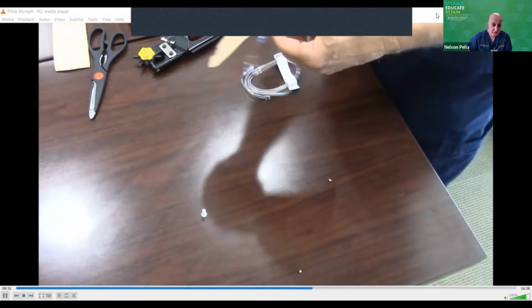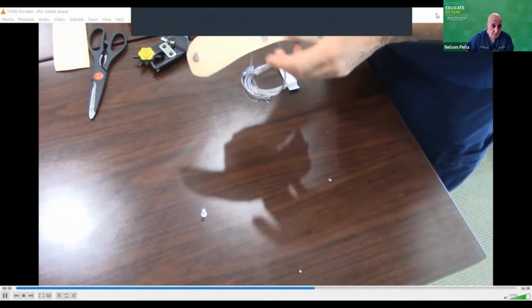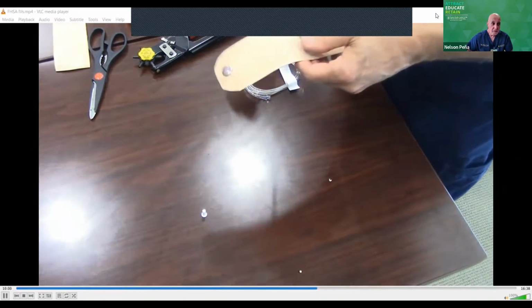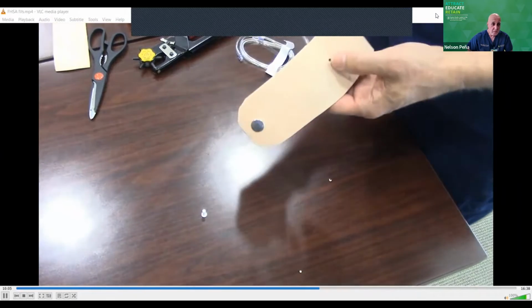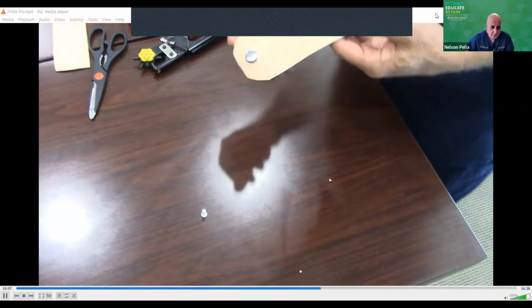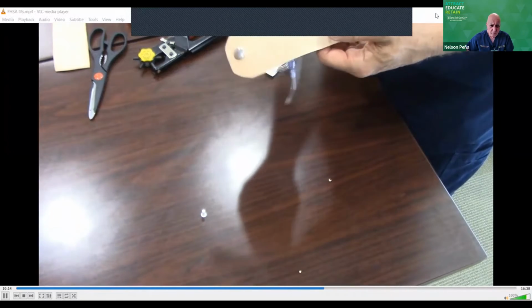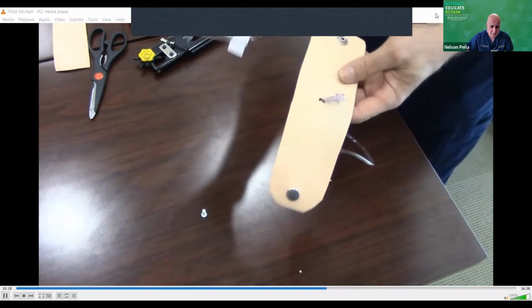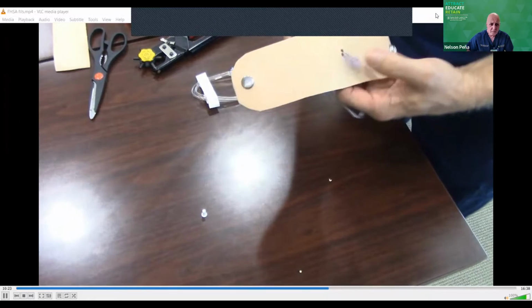So now you've got the connecting tubing where you're going to function as the IV hub on this side, and this side going through to the other side where you're going to connect it to the other high pressure line to use. Now the reason you use high pressure tubing, A-line tubing, hemodynamic tubing, is because it's hard and rigid and it won't collapse on you like IV tubing does. So that's why I use the hard, inflexible pressure monitoring tubing.